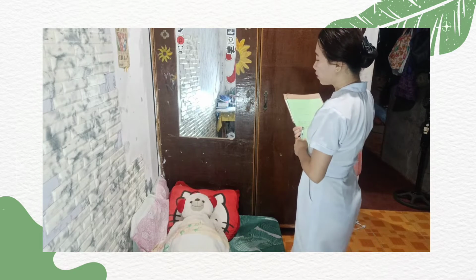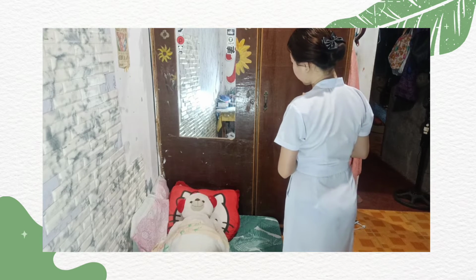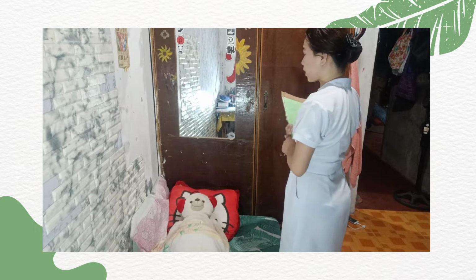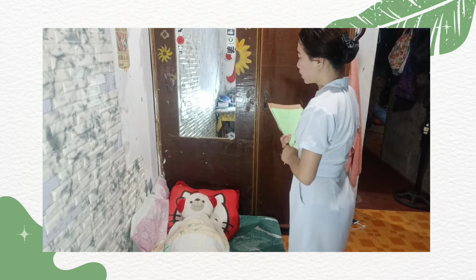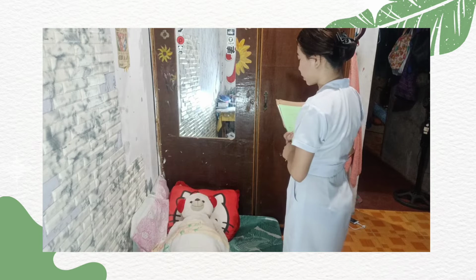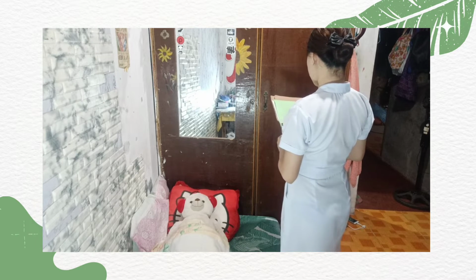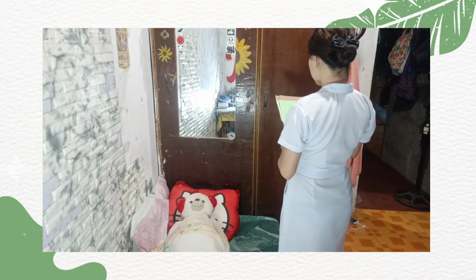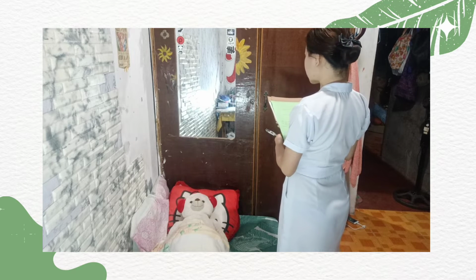Good day, ma'am. My name is Nicole Rigaspi Sasaluya. I am going to be your student nurse for today. Ma'am, may you please verify your identity? Kindly state your surname, name and middle name, and also your age and birthday. Okay, thank you, ma'am. Today the procedure that I would be doing is the urinary catheterization.